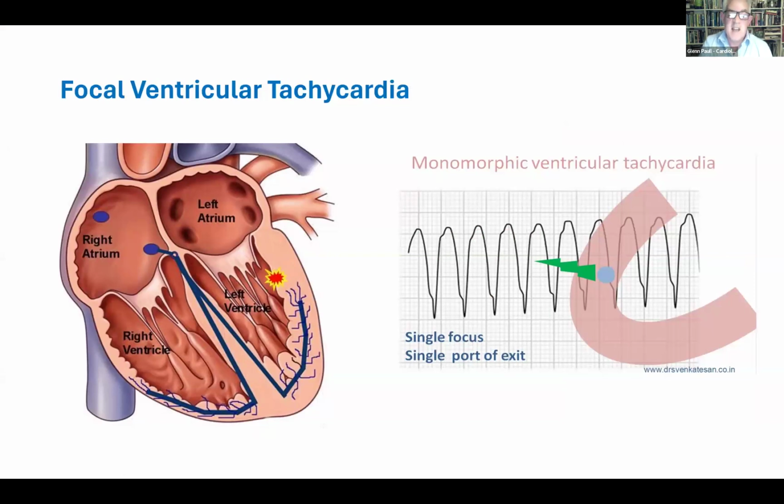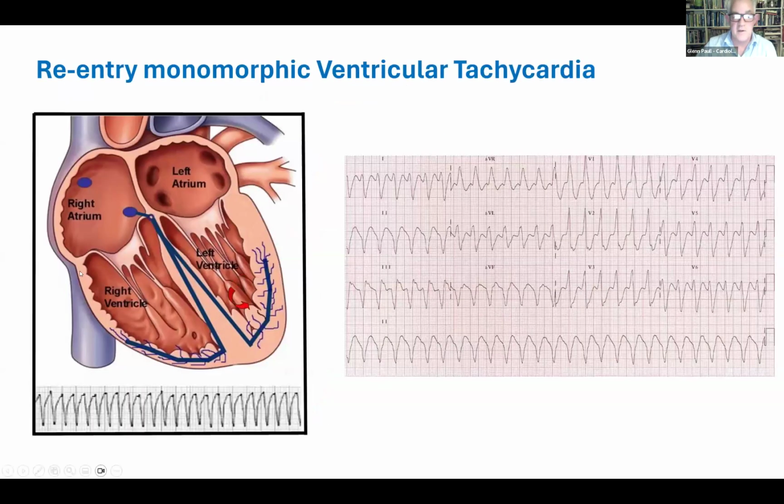We've got some tachycardia, some VT, that normally comes from repetitive firing, either from one focus, or you can get a re-entry circuit due to scar tissue. And that's where once it's wide and it's fast, anything that's wide and fast can be VT. It's not always VT, but that's what you should be suspecting. Because once again, people aren't going to like that heart rate. Once again, it doesn't really matter what the rhythm is.